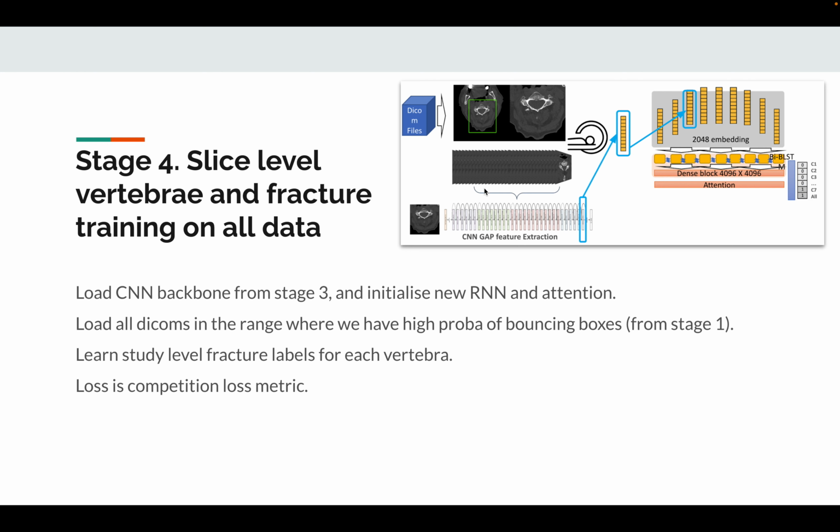You remember earlier we talked about the bounding boxes. We're able to say this is where the vertebrae bounding boxes start, this is where they end. So we take that portion, pass it in here, extract the GAP layer, and learn those study level labels. This model runs for about an hour, and the loss on this is just the metric that was given for the competition.